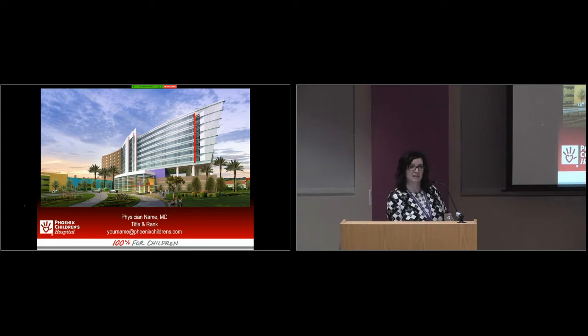Ian? Yeah, there hasn't been a research study on that. However, when we're placing lines from below, we want the tip to be just below, we're typically at the level of the diaphragm. So we think the IVC is still entering the right atrium above the diaphragm, but it has a nice straight vertical course. So we're going for diaphragm placed from below, so in the IVC.